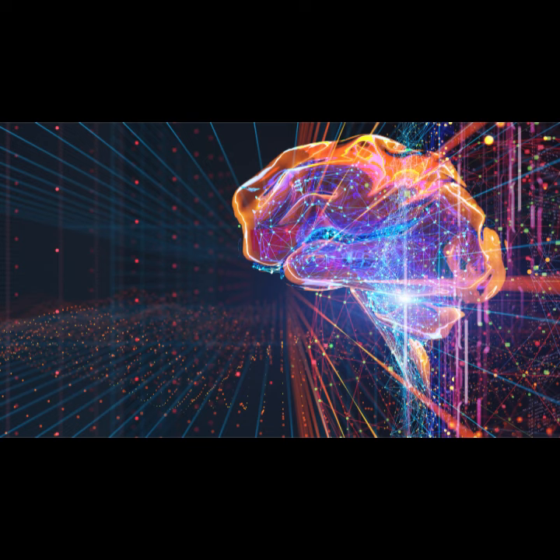before it's even built. Okay, so we've got 3 key takeaways on how this actually works. First, let's think about the map itself. K-space isn't uniform. Different areas hold different kinds of information. Those inner, central rows are super important because they define the overall image contrast, kind of the big picture, the low spatial frequencies. But the outer edges, that's where you get the high spatial frequencies, all the fine details, the sharp lines and contours. That brings us to the second point.